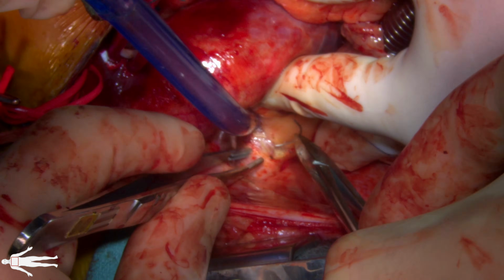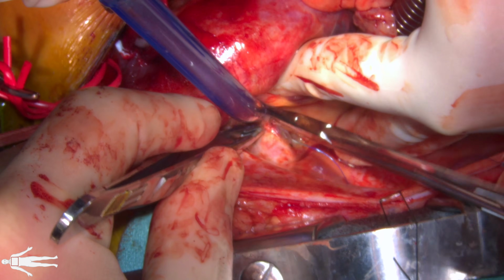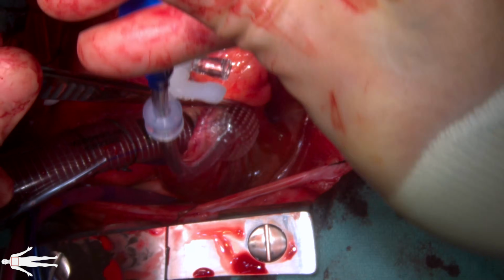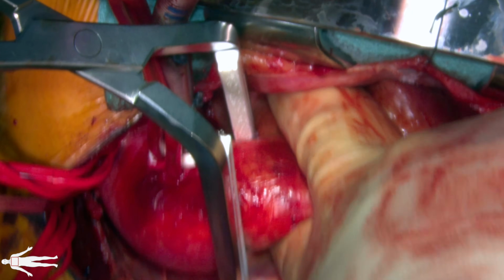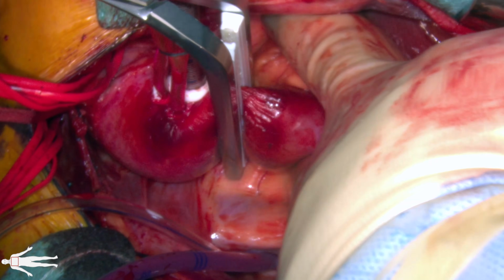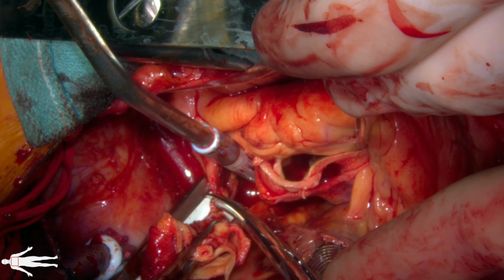The right superior pulmonary vein was then cannulated to act as a left ventricular vent. A retrograde cardioplegia catheter was directed into the coronary sinus under TEE guidance. The ascending aorta was then cross-clamped and retrograde cardioplegia was initiated. The ascending aorta was transected just above the sinotubular junction.